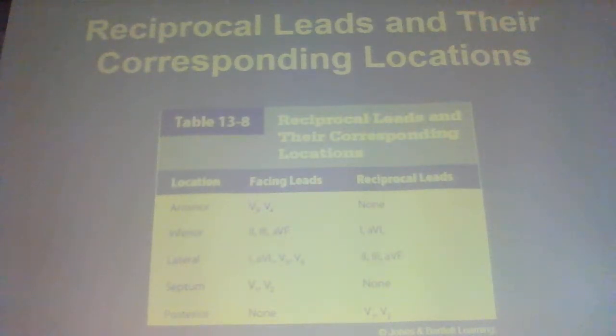You move 4, 5, and 6. You just take them and you move them in the same intercostal space. One goes right beside your spine, one goes at the tip of your scapula, and the other one goes at your posterior axillary line. So there's 3 right there. That looks at the back of the heart. Okay, that's an 18 lead EKG. 15 lead is your normal 12 lead, and then your 3 right-sided. 18 is 3 more in the back.